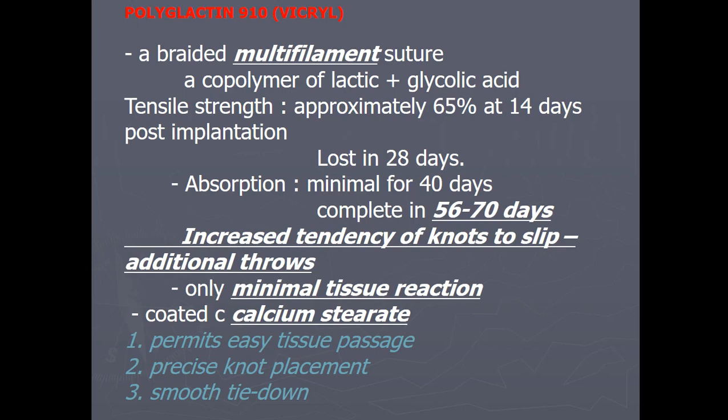Here there is an increased tendency of the knot to slip, so additional knots are required. Minimum 3 to 4 or 5 knots are required, because of the synthetic quality, and minimal tissue reaction is there.